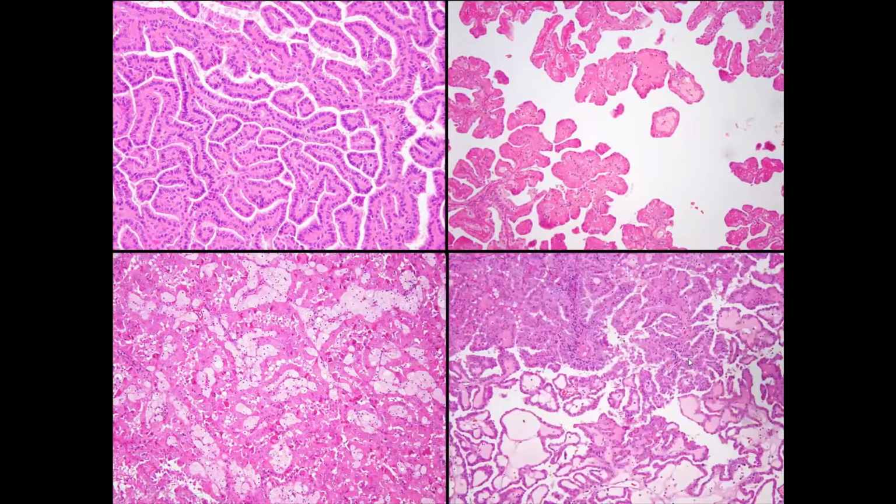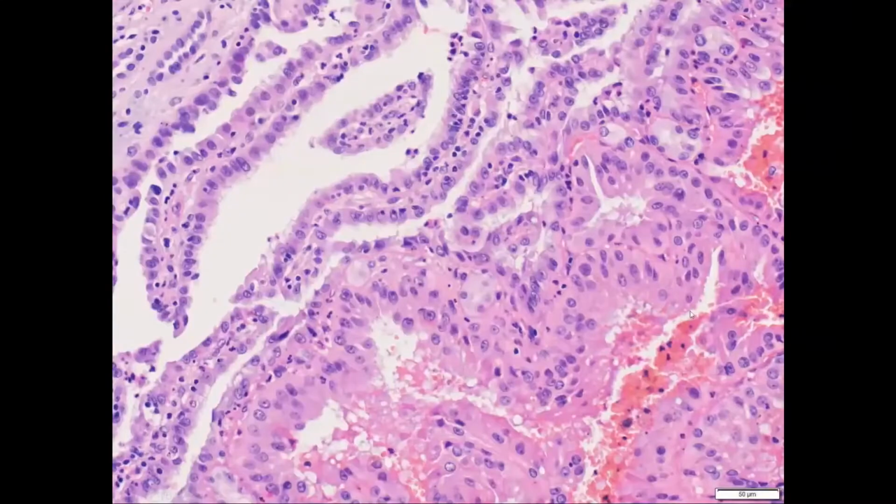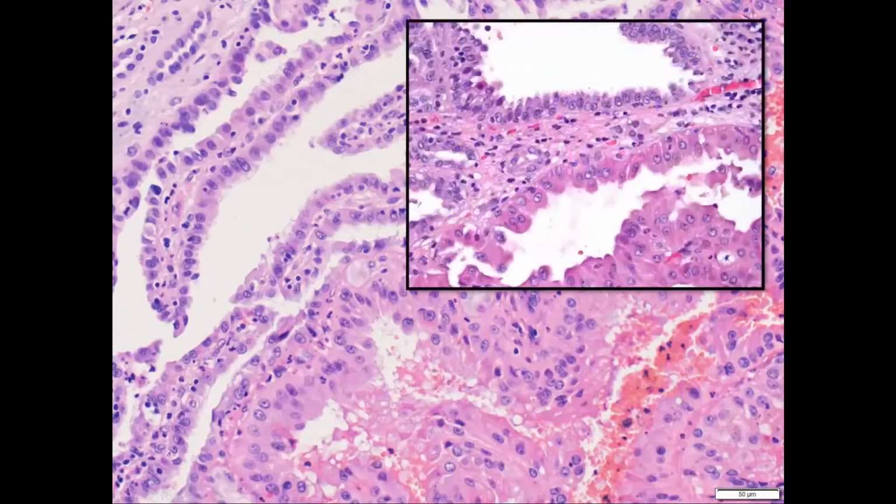And most cases actually start looking like this, because you have a combination of type 2 features and type 1 features, or morphology that is in transition between the two types. So it becomes very difficult to classify this. There are a few more examples where you find clear-cut type 2 areas very adjacent to clear-cut type 1 areas. Another example here: this is looking like a tubule of a type 1 carcinoma, whereas this one, with higher grade nuclei, abundant eosinophilic cytoplasm, and stratification, basically looks like a type 2 carcinoma, and these are adjacent to each other.